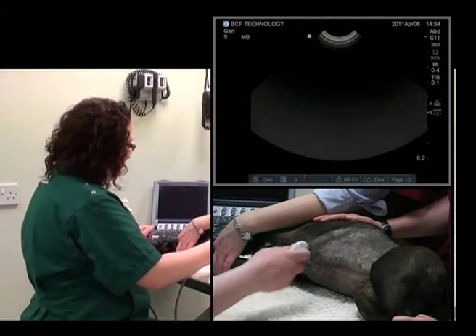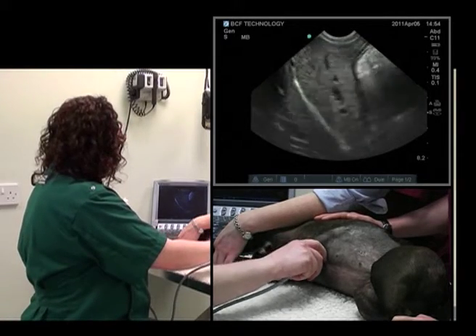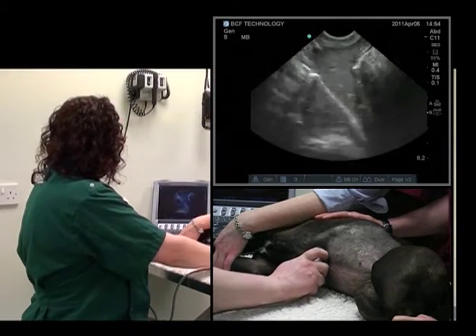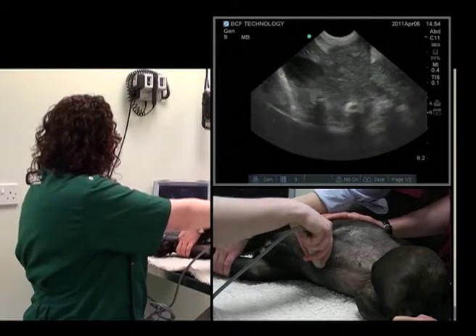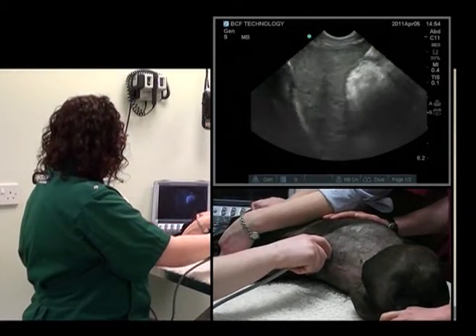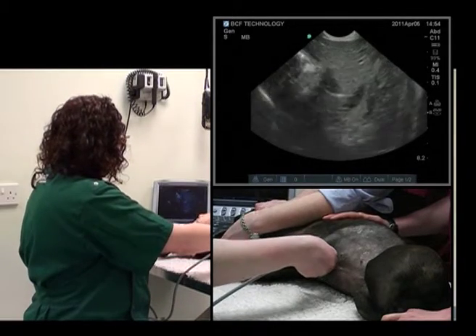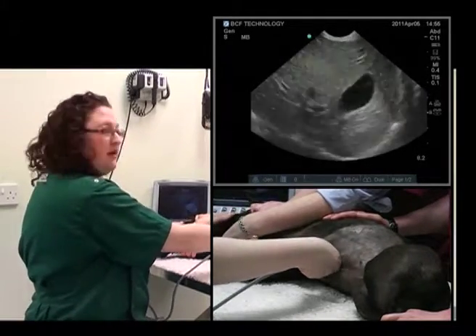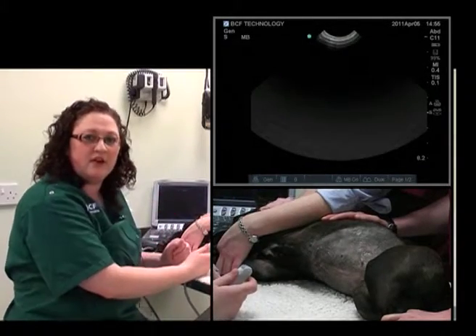We'll do that one more time. In the sagittal plane at the level of the xiphisternum, fan up — always keeping the image in the center of the screen — then fan down; the gallbladder comes into view and then disappears. Rotate 90 degrees, fan cranially, and fan caudally. We've now seen the entirety of the liver.